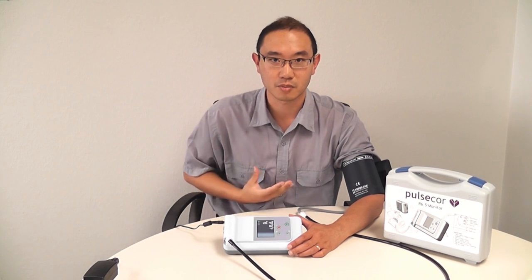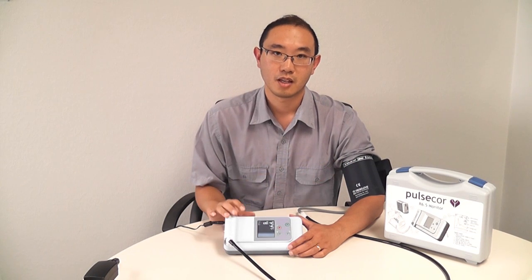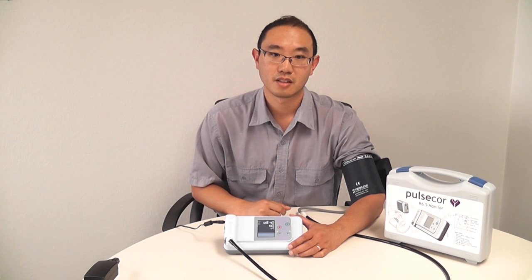I also have a pulse that comes out of my heart, goes down into the rest of my body via my aorta, and bounces back up and into my arm. And if my arteries are stiff, that echo will come back faster and it will come back louder. And that is what the device is listening for right now.